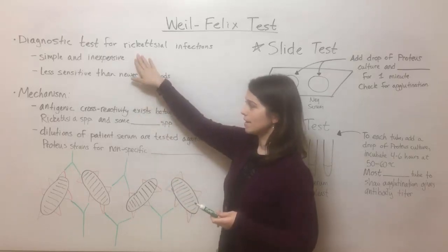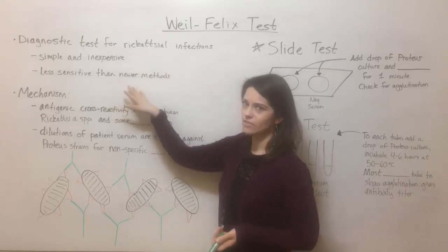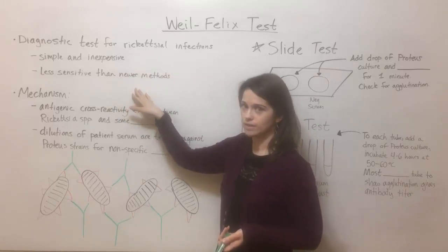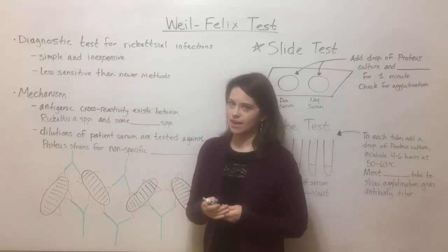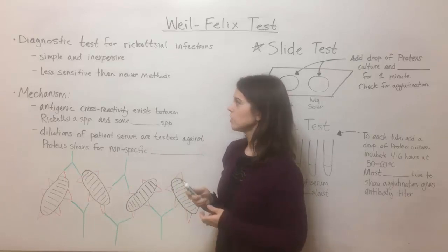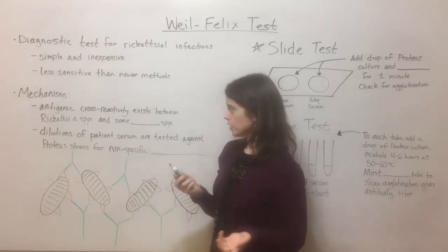It's a simple and inexpensive test. It is less sensitive than some newer methods like immunofluorescence antibody assays, but because it is so simple and inexpensive to carry out, it is still pretty widely used. So let's talk about the mechanism, how it works.